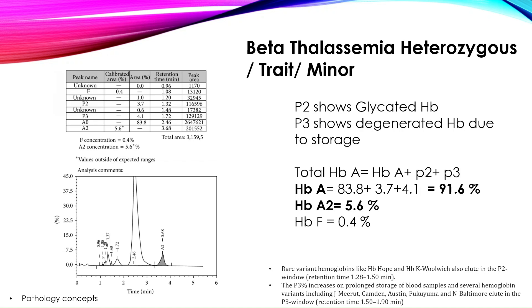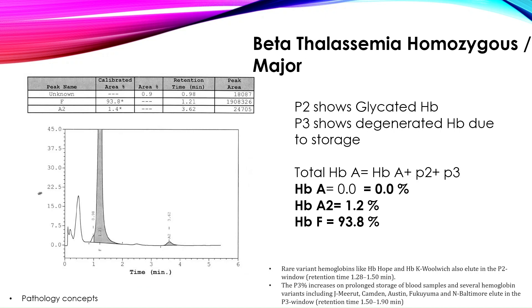Beta thalassemia heterozygous (trait or minor): HbA is 91.6%, HbA2 is 5.6% (more than 4%), and HbF is 0.4% — consistent with beta thalassemia trait or minor. In beta thalassemia major, the graph shows the majority as fetal hemoglobin: HbF is 93.8%, HbA is 0%, and HbA2 is 1.2%.